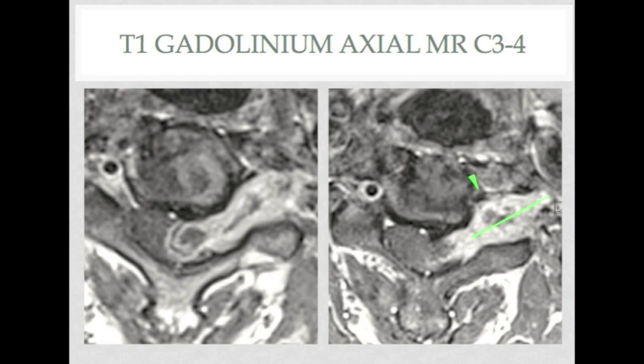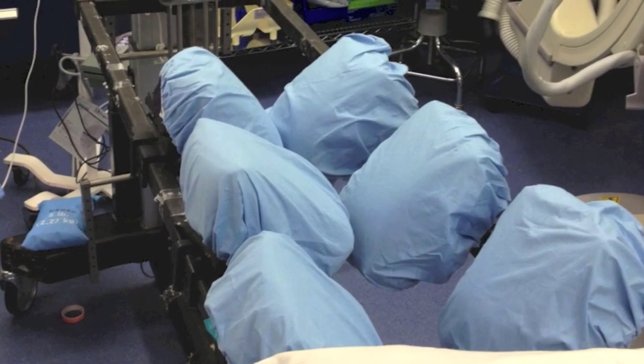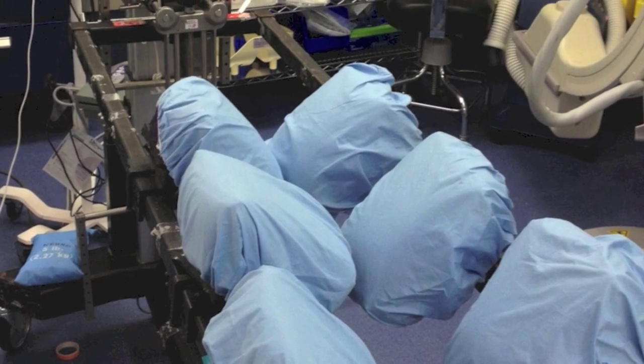The small arrow on the right identifies the left vertebral artery, which has been displaced anteromedially by the tumor capsule. Contrast-enhanced coronal MR also documents the extent of the tumor within the spinal canal, C3-4 foramen, and anterior paraspinal space. For this case, we'll use a Jackson frame with a Mayfield head holder.